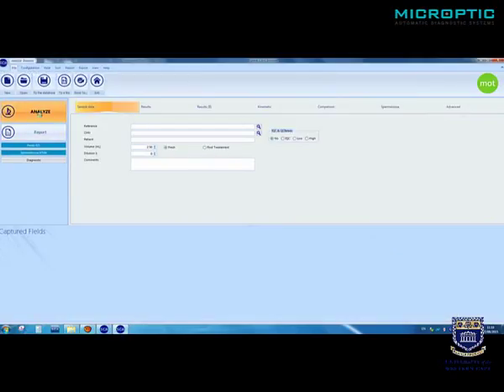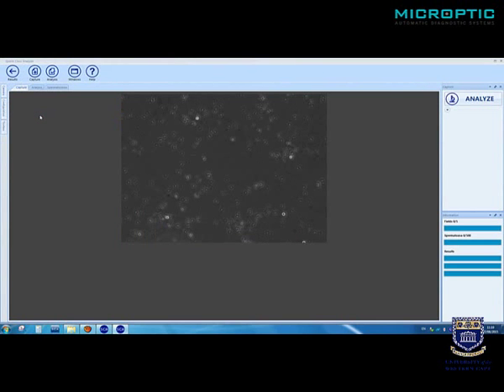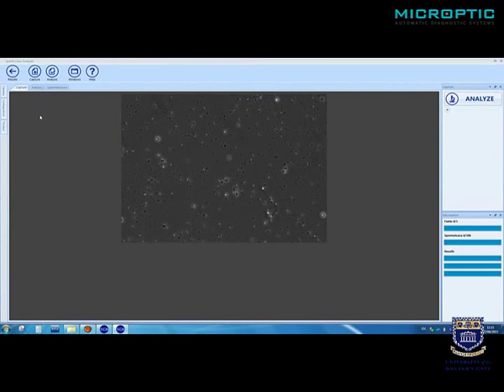We're going to analyze now. We focus sharply on the sperm. It's not a particularly good sample, which is typically what one gets in the clinical situation. I'm just optimizing the light a bit. And we analyze.